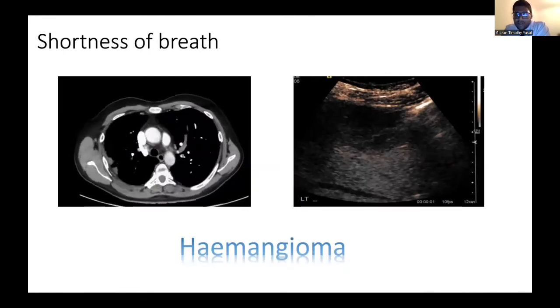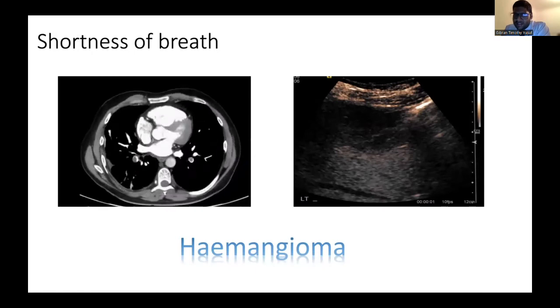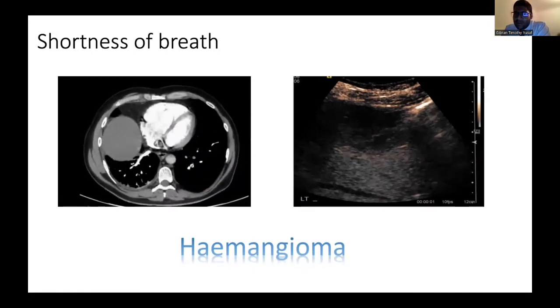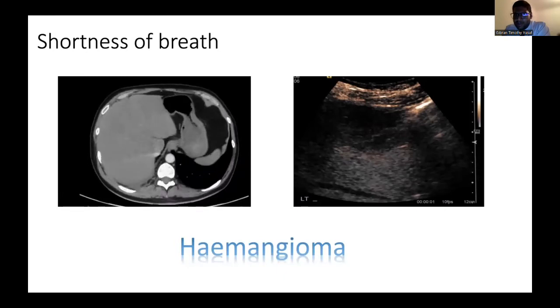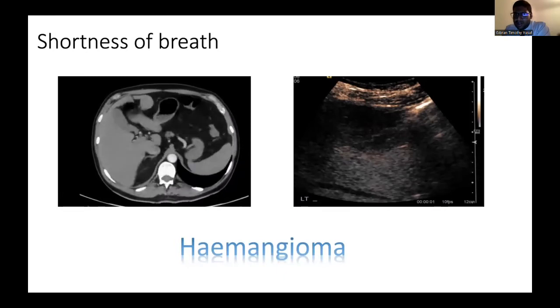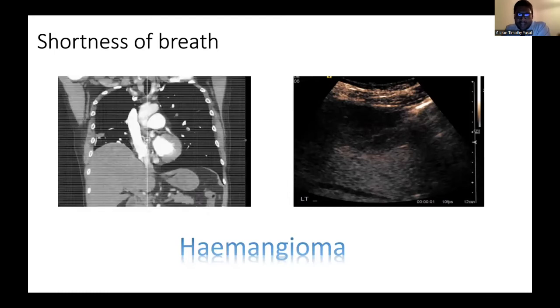He has large volume bilateral pulmonary emboli. On the very last slices of his CT, he was found to have a liver lesion. The patient was very unstable, couldn't move back out of A&E. It was only looked at after he came out of the scanner. And the fear was a subcapsular HCC that would bleed if he was thrombolized.